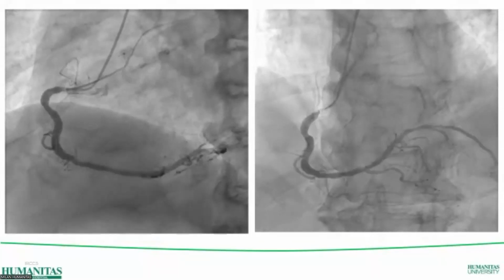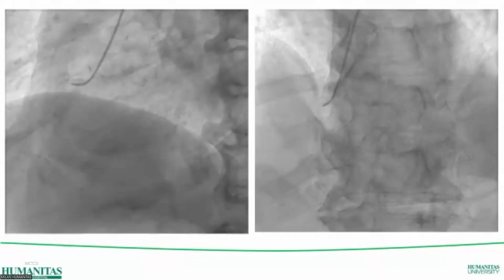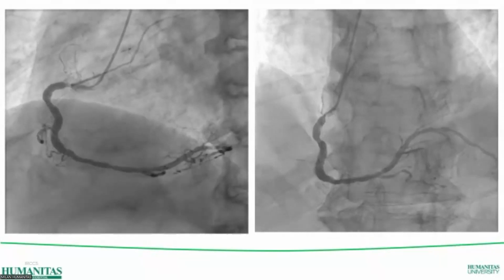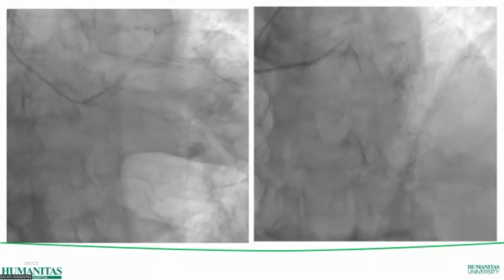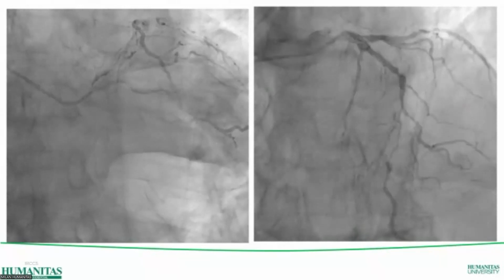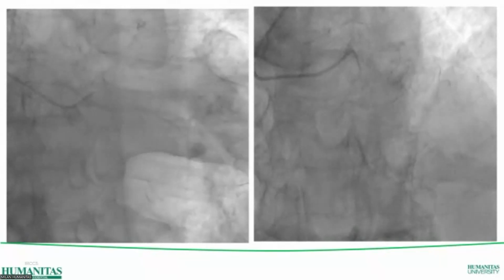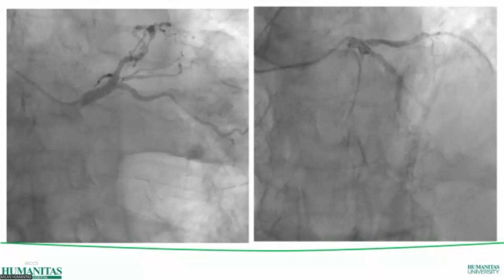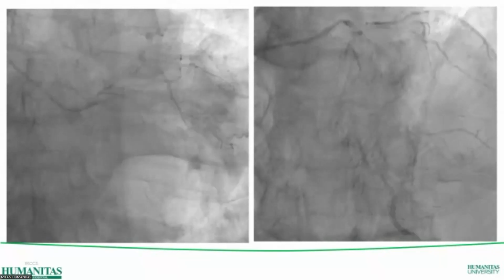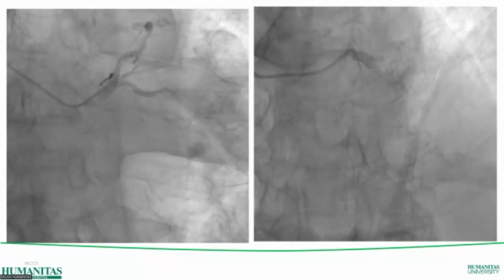And you can see that the ostial proximal RCA is severely calcified, and there is mild disease in the distal RCA and PDA, PLV. Next. In the left system, you can see the large OM had the critical stenosis, and the RI is moderately diseased, the proximal LAD having mild disease. But the mid LAD is critically severe calcified stenosis, followed by a type C long lesion up to the early LAD. So this was the angiography.